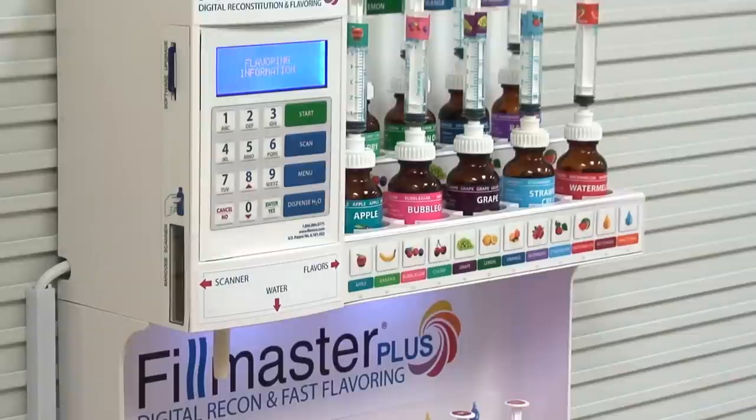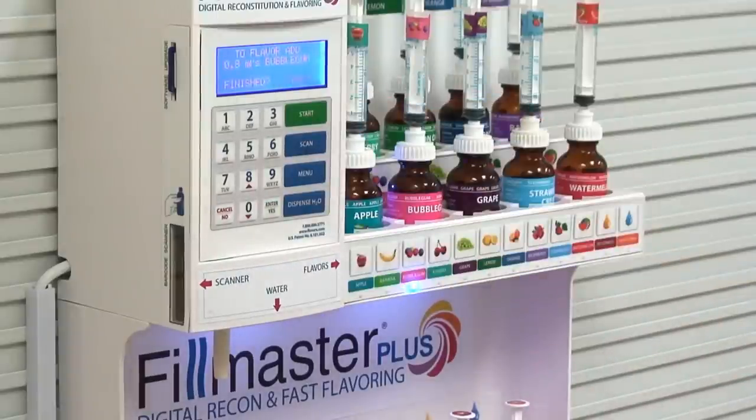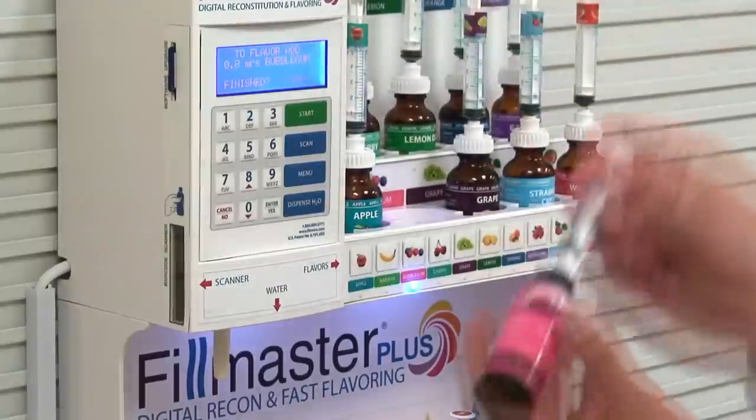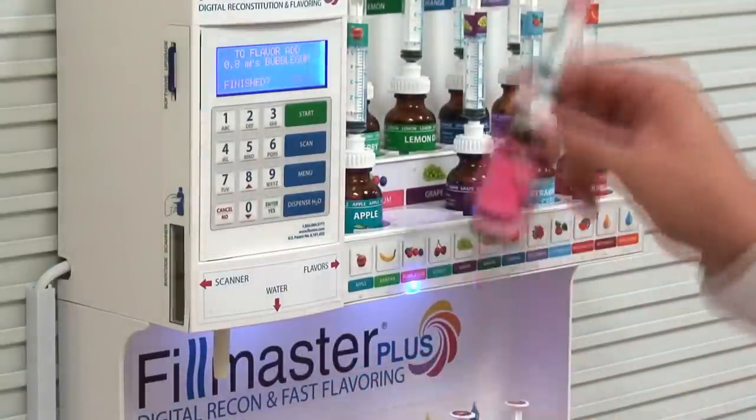Once reconstitution is complete, flavoring instructions will appear on the screen. In this case, 0.8 mLs of bubblegum flavor, and that is reconstitution and flavoring with the Filmaster Plus.